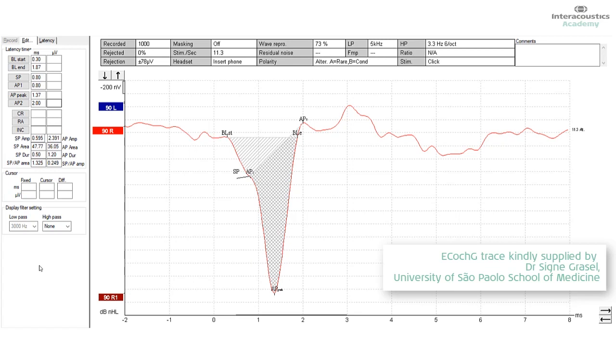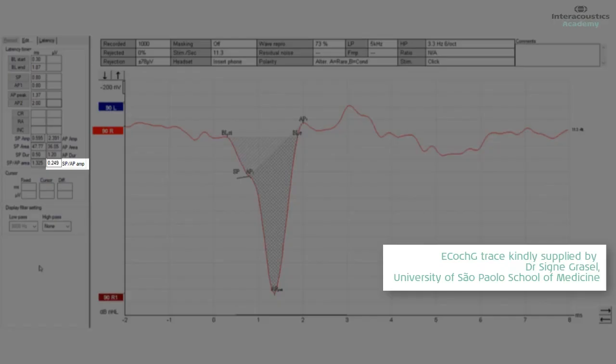And to form the amplitude ratio between the SP, we simply divide the AP amplitude into the SP amplitude, but the software in the Interacoustics takes care of all of that for you.